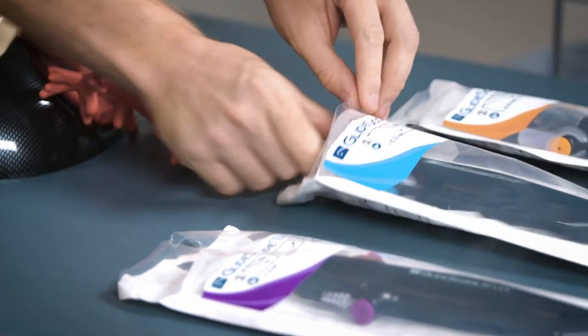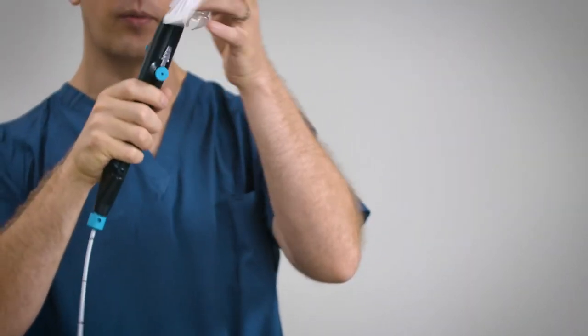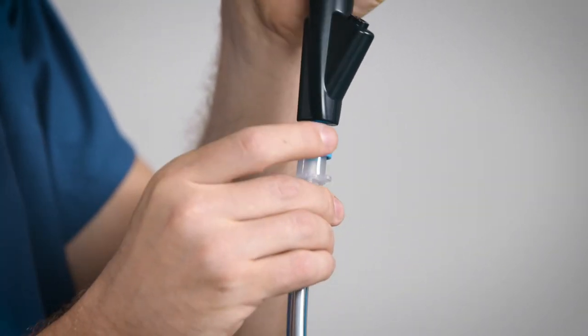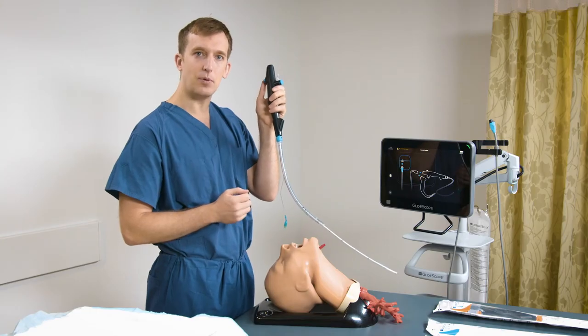I'm now ready to remove the bronchoscope from its packaging, removing the plastic cover from the insertion tube and the plastic cover on the handle as well. One cool feature of the B-Flex bronchoscope is the tube retainer ring — this blue ring just under the handle here — that will anchor an endotracheal tube, allowing me to perform a procedure hands-free without using tape or an assistant.